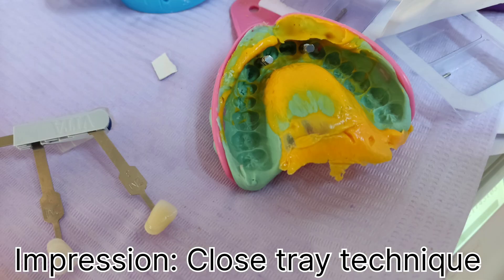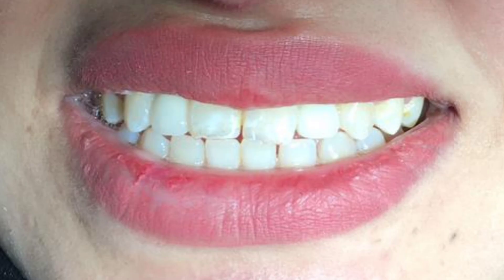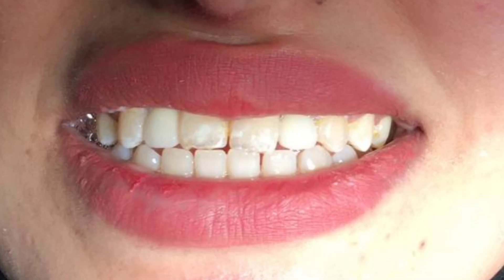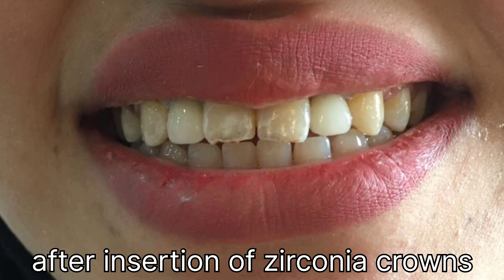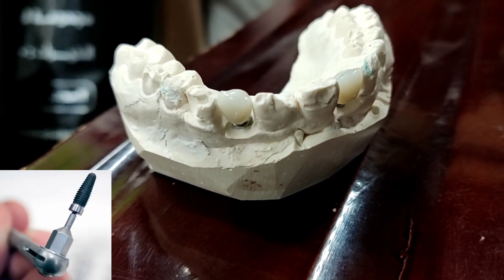The T6 Torque is a standard dental implant produced by Nucle OSS. It is a bone level implant. Its connection is internal with a hexagon shape with internal bevel. Its body is tapered with V-shaped threads. Its head is straight and has a bevel. Its apex has a dome shape, doesn't have a hole, and has grooves.